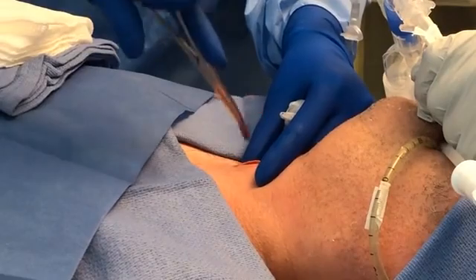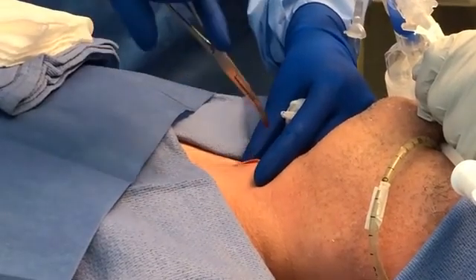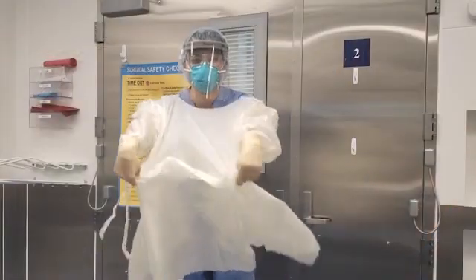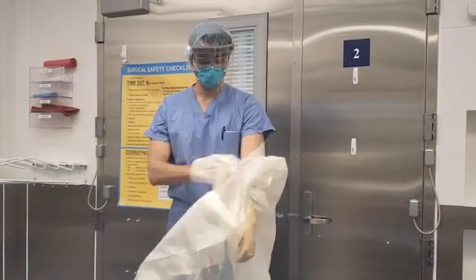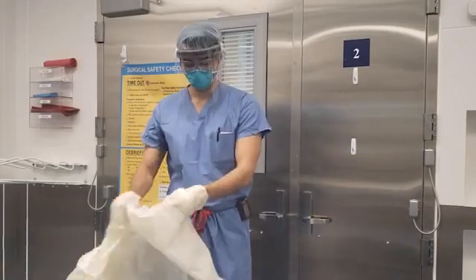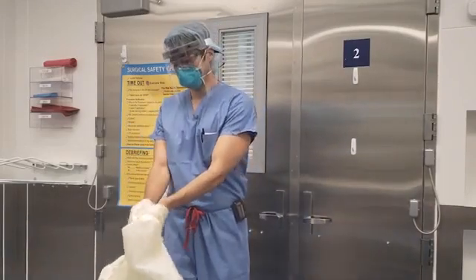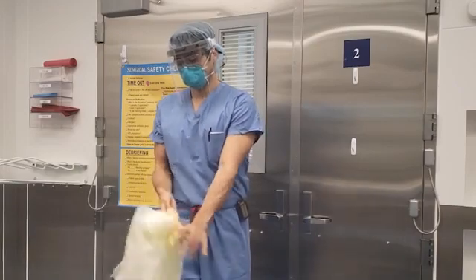Percutaneous tracheostomy can be safely performed at the bedside in patients with a prolonged need for mechanical ventilation. In patients with COVID-19, this procedure can be modified to minimize aerosol generation and exposure to staff.